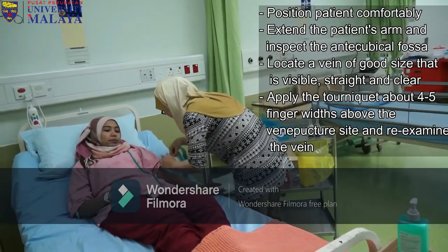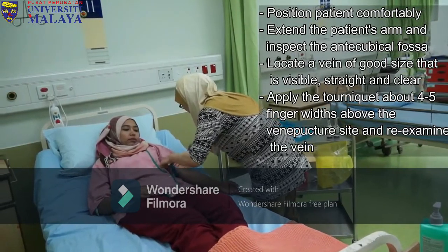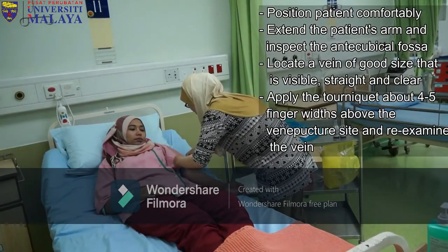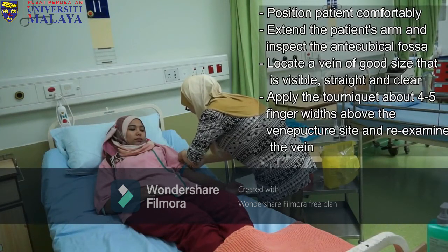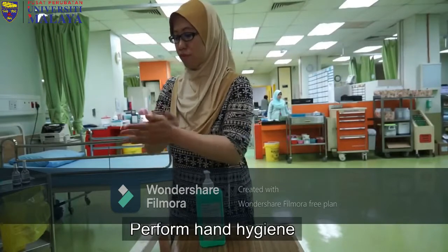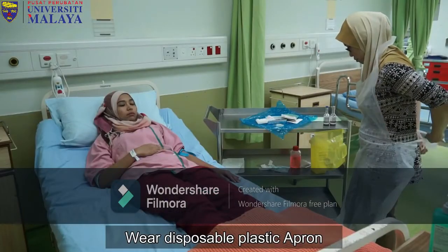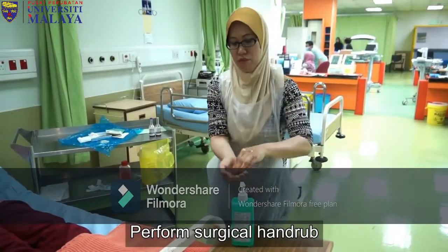Locate a vein of good size that is visible, straight, and clear. Apply the tourniquet about 4 to 5 finger widths above the venipuncture site and re-examine the vein. Perform hand hygiene and wear a disposable plastic apron. Perform surgical hand rub.